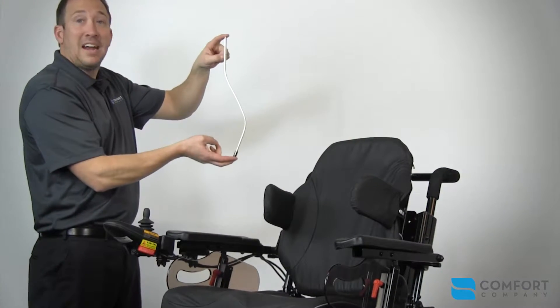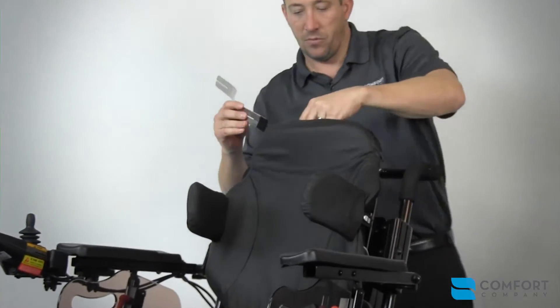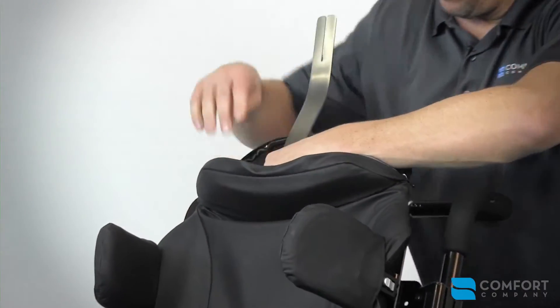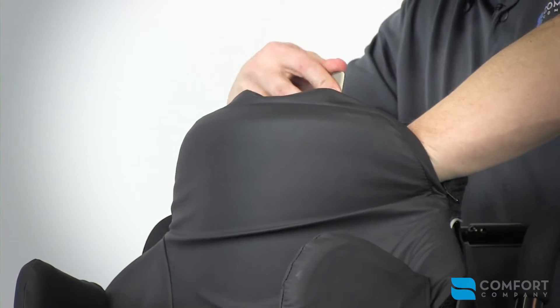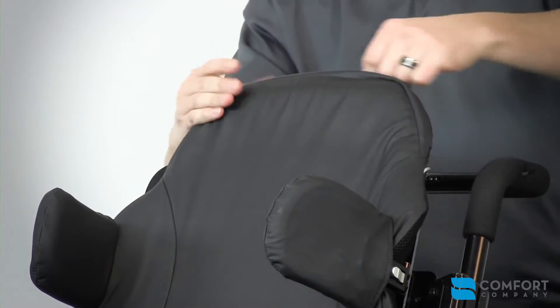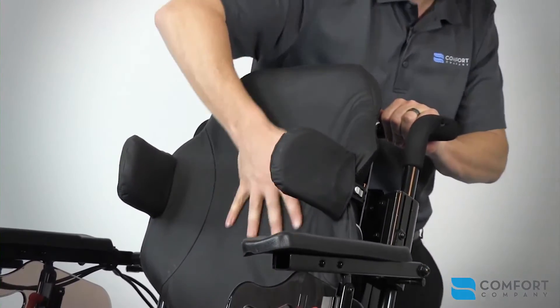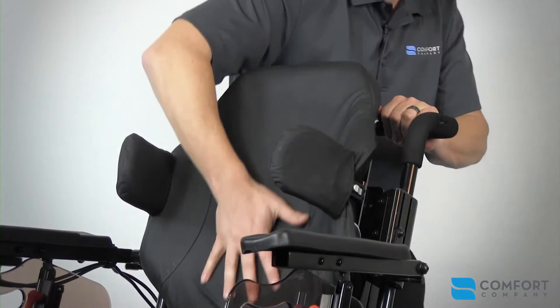Once molded, simply slide it back into the cover. Make sure you push it all the way down and close the back up. You now have a nicely contoured back to fit your patient.